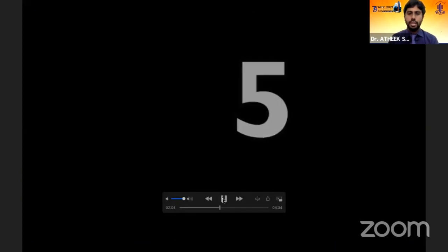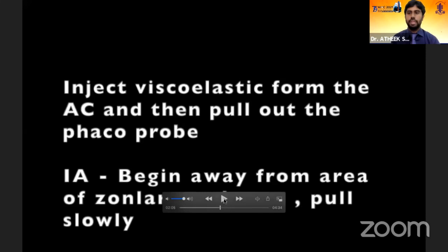After phaco is over, when taking the probe out, again, we should be very cautious. This should be treated like a case with a posterior capsular rupture or a case with zonular dehiscence. If you pull the phaco probe out, there is a high chance that the anterior hyaloid face may be disrupted and vitreous may come through the colobomatous area. So inject viscoelastic and then pull the probe out.